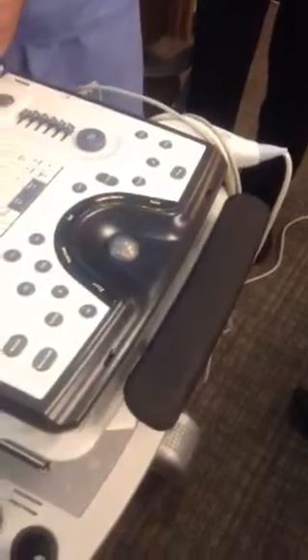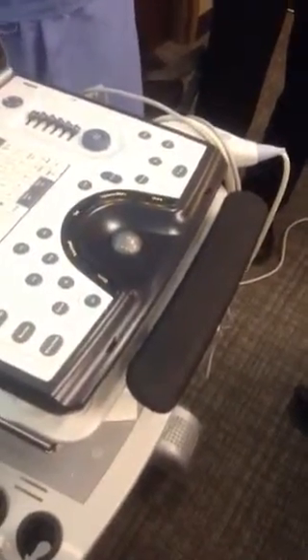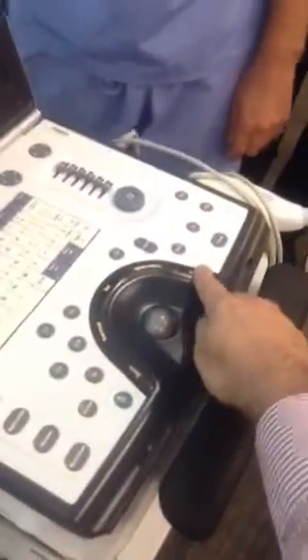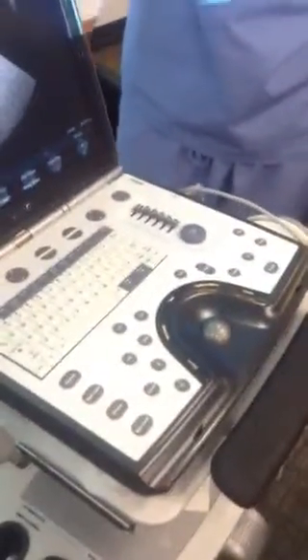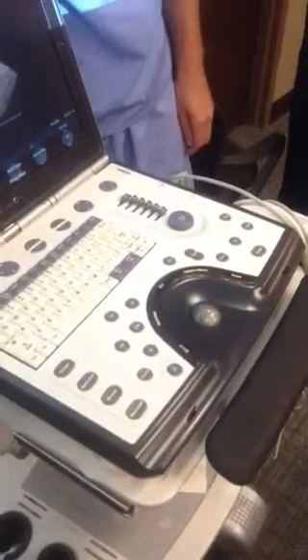When you hit store, what it does is it's going to show you your picture. It's not going to save it until you hit store again. So you have to hit it twice. So go ahead and hit it again. Now you stored an image. You know the image is stored because it shows up down here at the bottom of the screen.